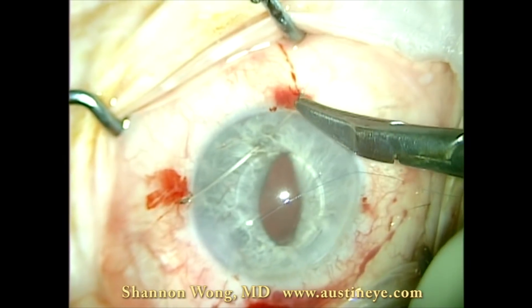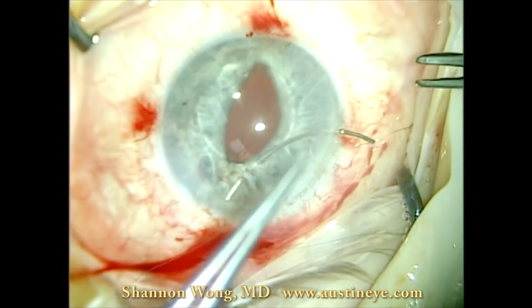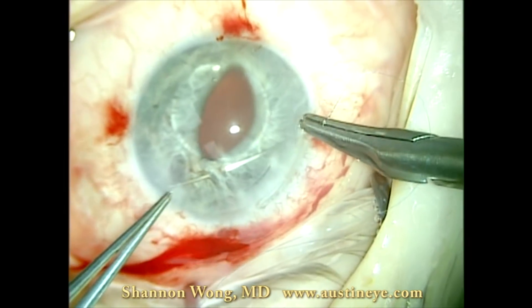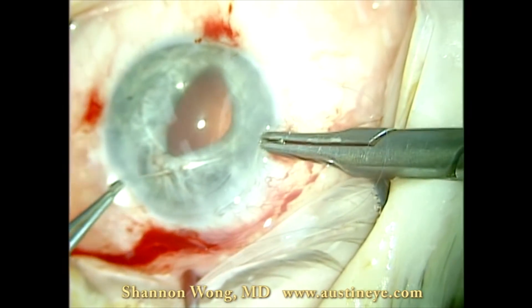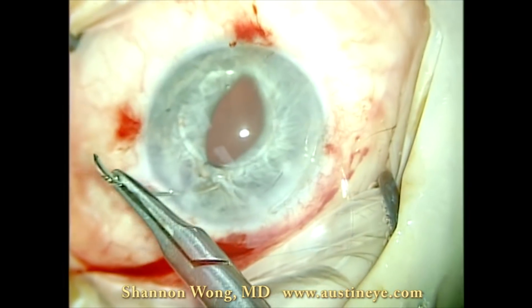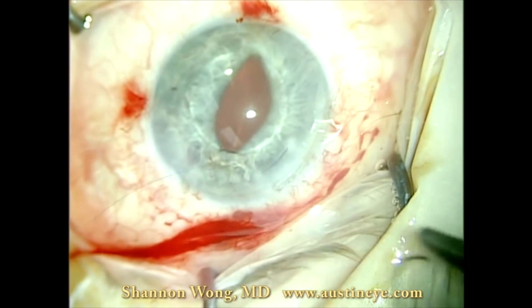I'm entering through a pre-made 1mm opening and exiting through a pre-made 1mm opening that we created initially. We do the same thing for the inferior haptic — entering with a long needle affixed to 10-0 prolene. We have created two paracentesis openings, in this case at 4 o'clock and 8 o'clock.